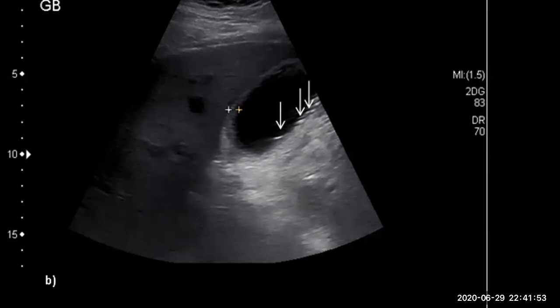To differentiate from a polyp. Sometimes a detached polyp, you can see it in the gallbladder lumen. How to differentiate a detached gallbladder polyp from a stone? You should change the probe, okay? Change the probe. Any question?